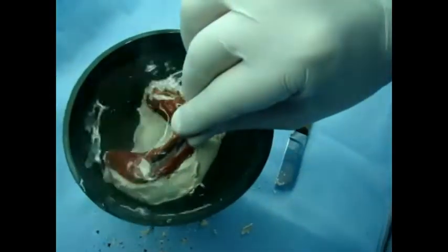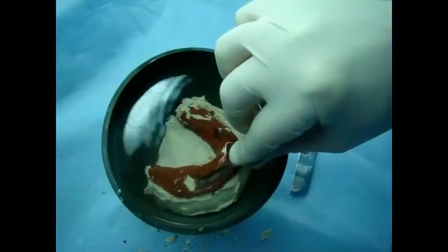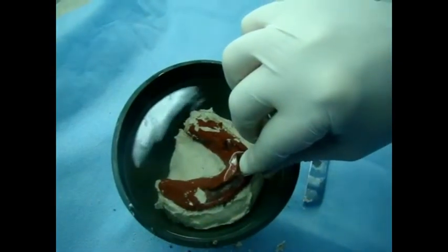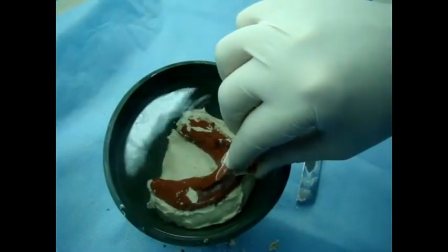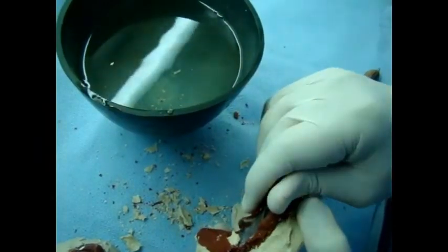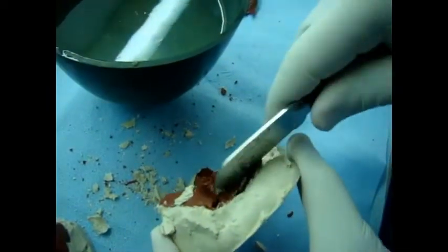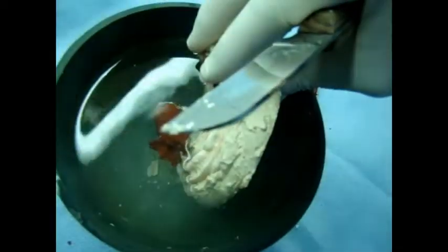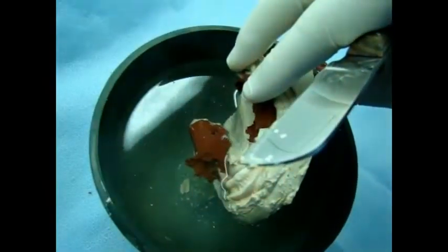Then it will be easier to separate the compound from the cast. By pivoting the tray from the cast it can be removed. Soaking for a few seconds will be sufficient to soften the impression compound and make removal easier. The tray has been removed and the excess compound is now removed from the cast.